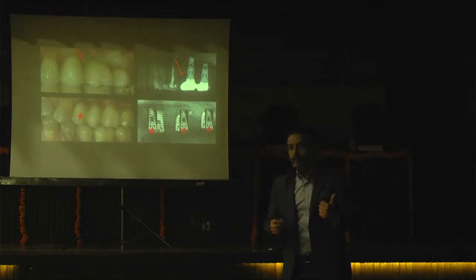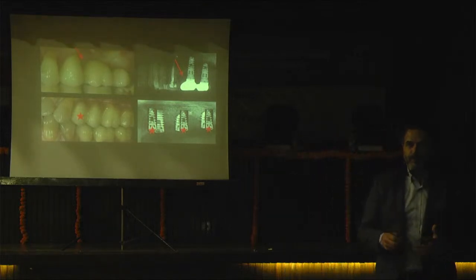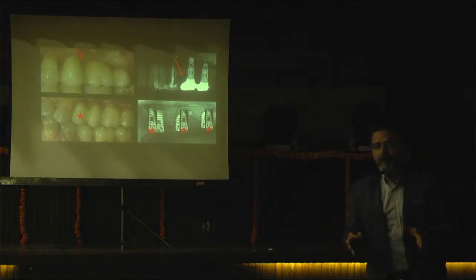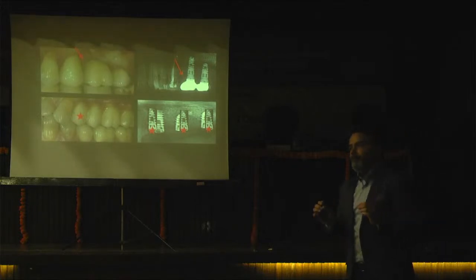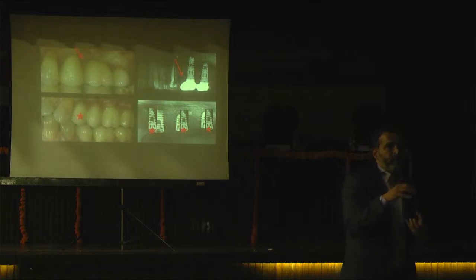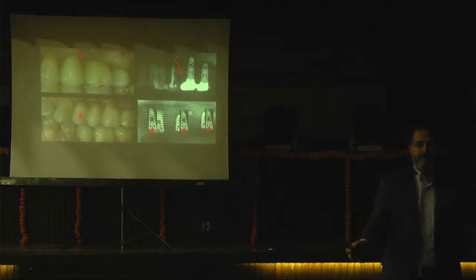Why did you make 4 crowns?" Okay, a very good question, because I don't know what to say. It's about the lack of planning. After finalizing everything, you have only one chance to adjust the inner part and the upper part. And it's just like solving a problem, not giving the best option.